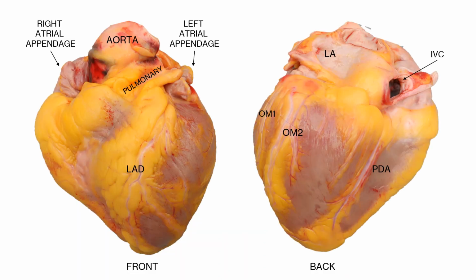Okay, now that we've discussed coronary arteries, let's get into opening the heart. So again, the process is coronary arteries first, followed by opening the heart. Just to reorient ourselves, because grasping this anatomy will probably be one of the more challenging concepts you'll have on this service of the heart.